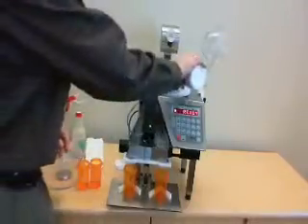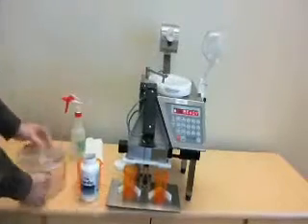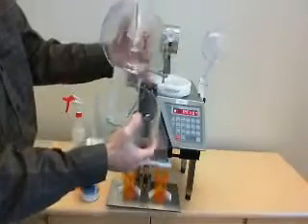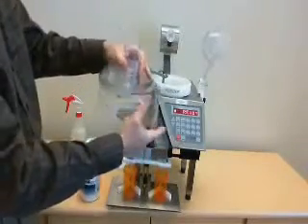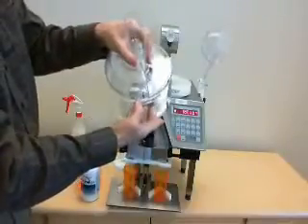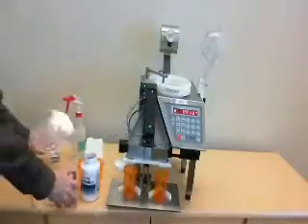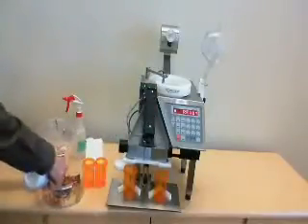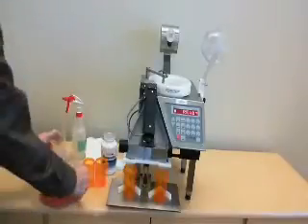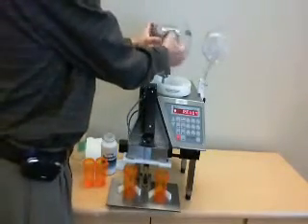We're going to fill a certain amount into the bowl, and then we're also going to fill into the feeder. This is a simple spring load opening, and there's also a mechanism to control the flow of medication coming out depending on the size of the tablet or capsule. This opens and you pour your medication in. And this simply snaps on by a magnet.